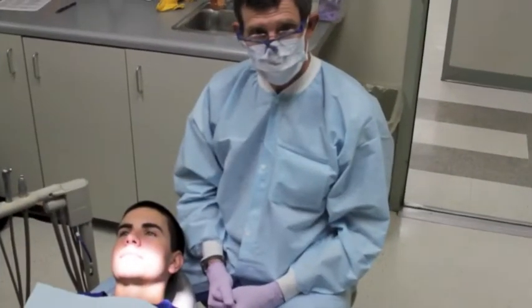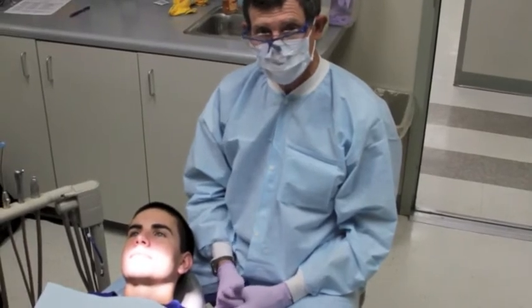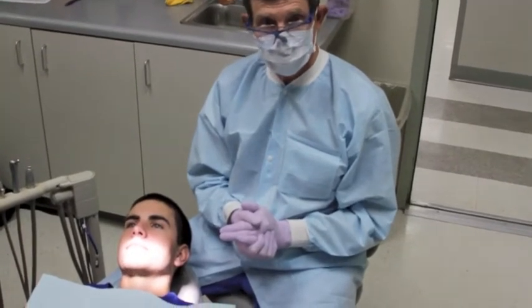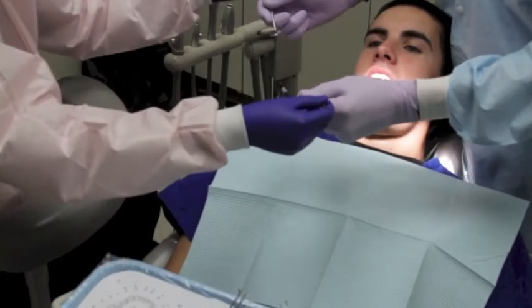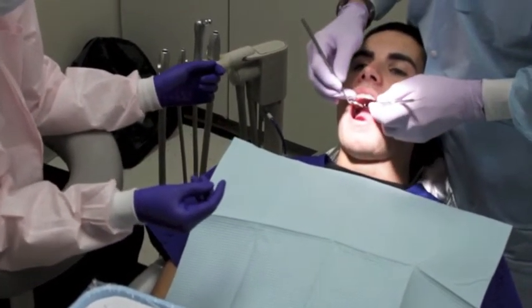One of the things that we're going to do right now, my assistant Q and I will be demonstrating to you the general principles of four-handed dentistry, but the specifics will be defined to you by the doctor that you work with. In this initial transfer of the mirror and explorer, notice how both instruments are transferred together.